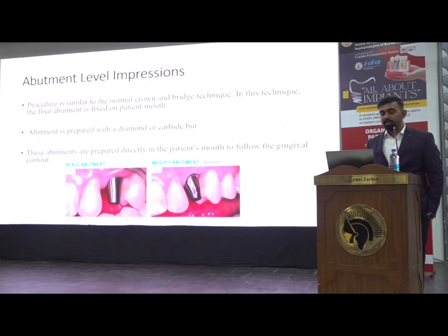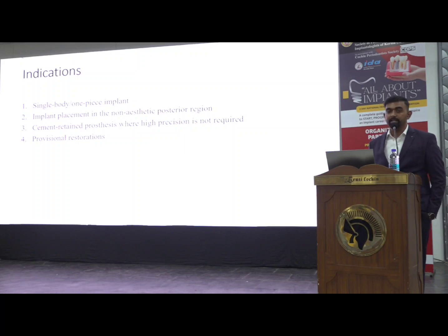Okay, once after taking the impression, we will send this impression to the lab, and Dr. Alan will cover the trial and fit-in part.